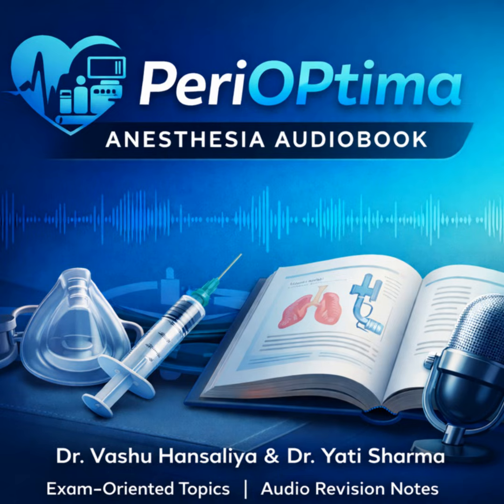For a top-tier long answer, it's good to mention a few specialty blades to show the depths of your knowledge. Definitely. Think about the anatomical challenges. What if you have a patient with severely restricted neck mobility or maybe kyphosis? The angle between the handle and the patient can make a standard lift impossible. That's where something like the polio blade comes in. Precisely. The polio blade offsets the blade from the handle at an obtuse angle. This allows your hand to clear a large chest or breasts. But there's a trade-off. A big one. You get less control, and you can't apply as much vertical lifting force safely.